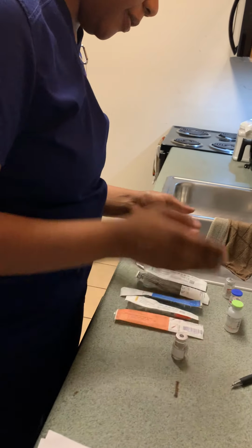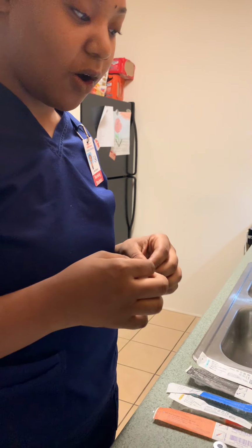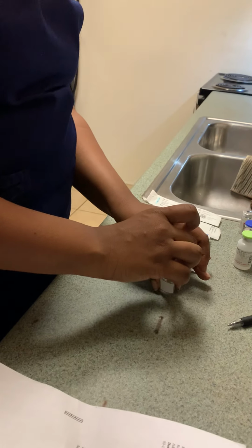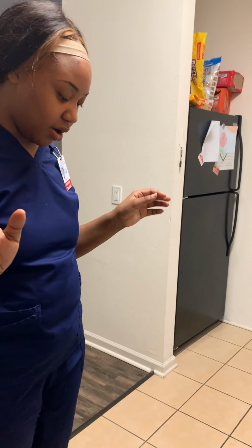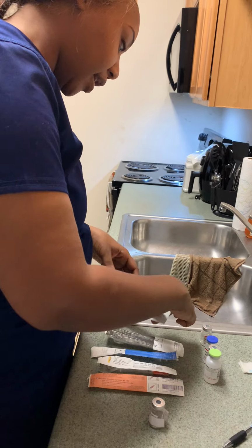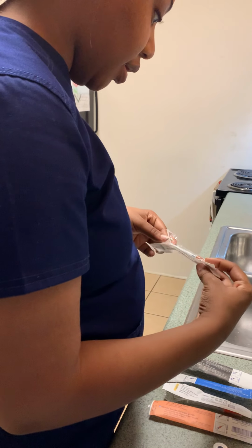Alright, I'll perform hand hygiene once again, and I will use my alcohol pad. I do not have any alcohol pads, so I'll be using a paper towel, and I will wipe around the vial and the inserting point. Then I will discard it, and I will retrieve my 1 milliliter tuberculin safety syringe to get my medication.